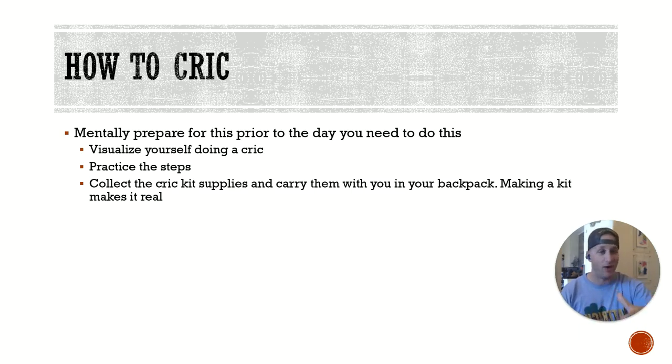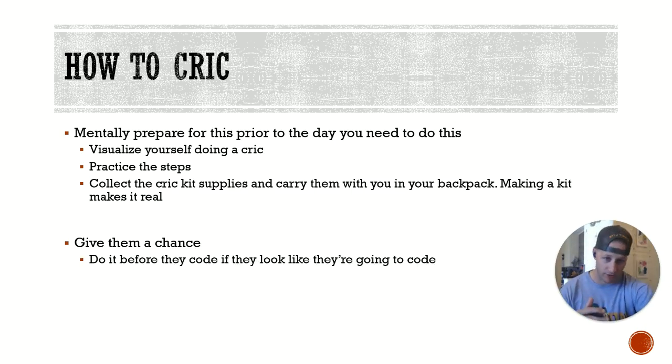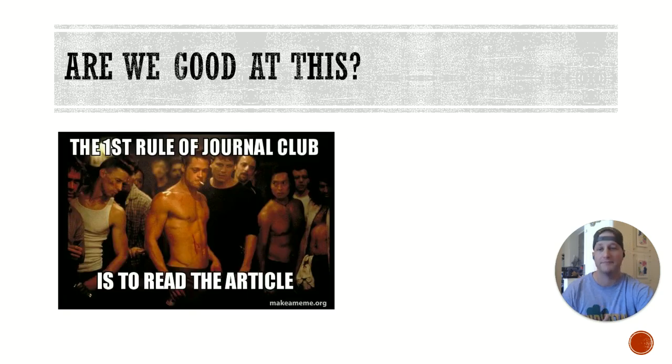Because you say, hey, now I have this piece of equipment. If I don't know how to use it and I need to utilize it, that's a problem for me. Okay? Give them a chance. Cric them before they code. If they look like you're going to code, don't wait until they've been coding for 10 minutes and you can't get the airway before you try to do this. Okay? Do it early.